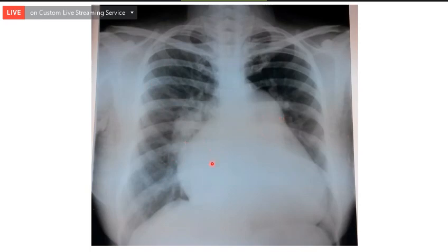So you have to differentiate whether there is pulmonary artery hypertension. Very doubtful. Do you think that there is an increase in the pulmonary vascularity? Yes, sir. It's looking increased. What are the features which help you to diagnose increased pulmonary vascularity? Just now, you mentioned. End-on vessels, sir. That is one criterion. And what else? More and more vessels are reaching the periphery.